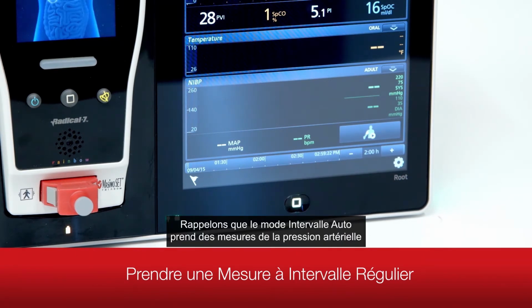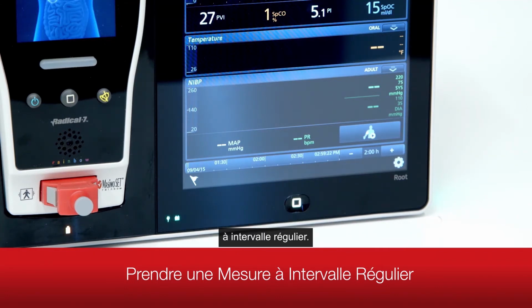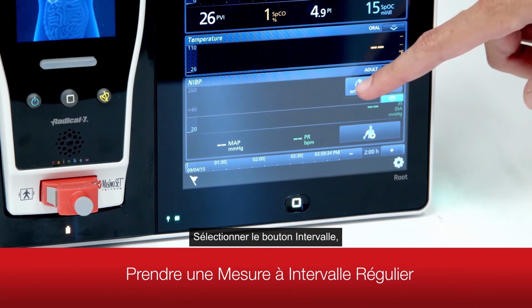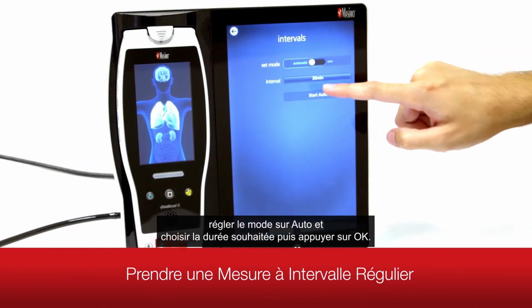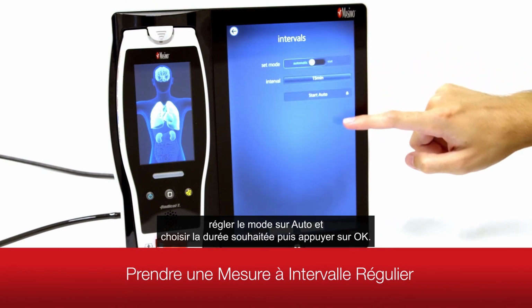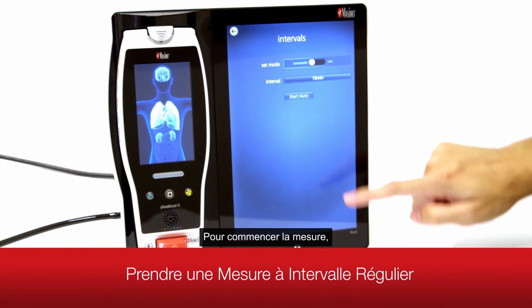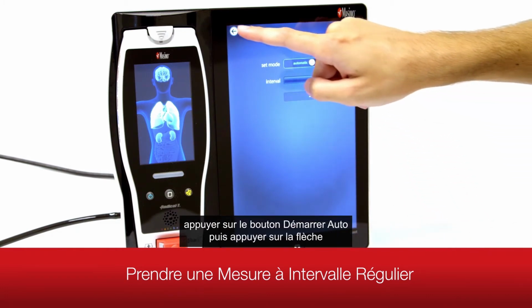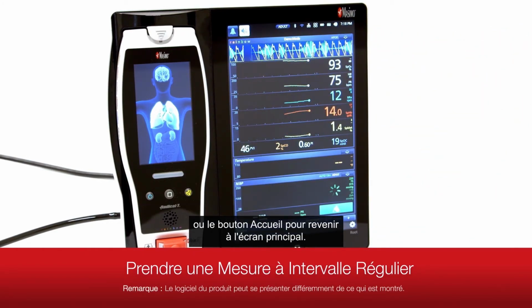Recall that the automatic interval mode will take blood pressure measurements once every desired interval. First, set your interval settings by touching the Action menu in the NIBP window. Select the Intervals button. Set the mode to Automatic, and then select the desired duration and touch OK.